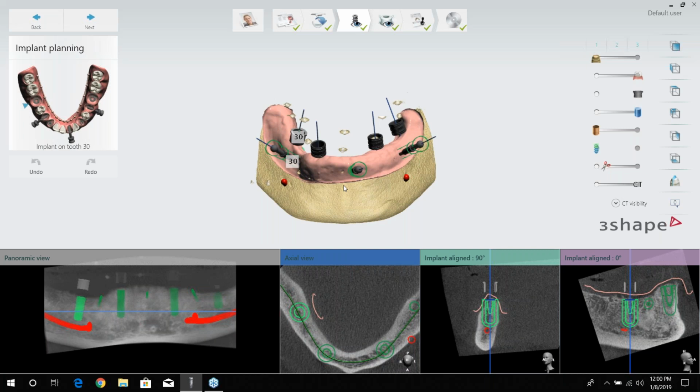Okay, we have 3 more, unless more come in. I know that some companies have set height for sleeves when designing the stent. Is there a way to override the heights? Like Nobel has 3 heights, 2, 4, or 6, I believe.